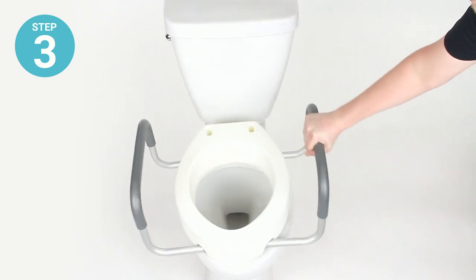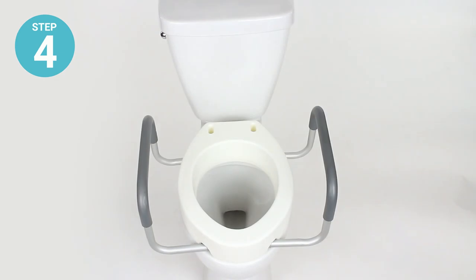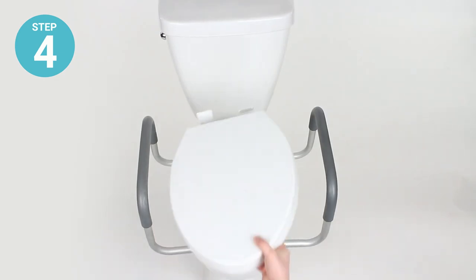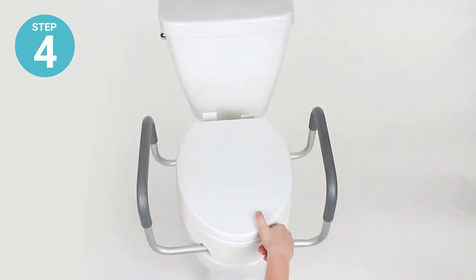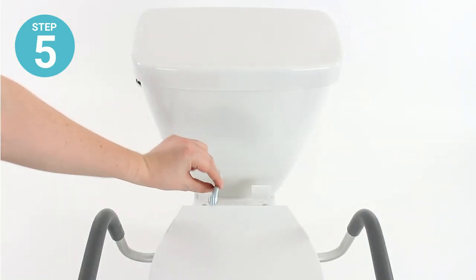Step three: set the riser on the toilet and ensure that the holes in the riser and the holes in the toilet are aligned. Step four: place the toilet seat on top of the seat riser and align the attachment holes.